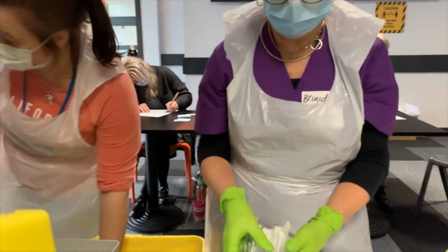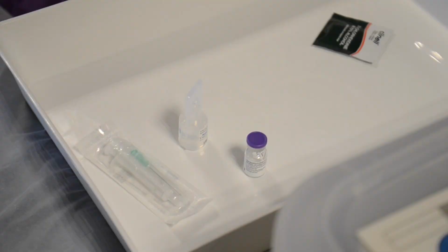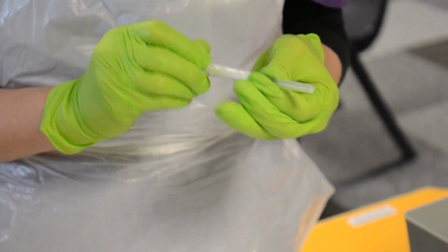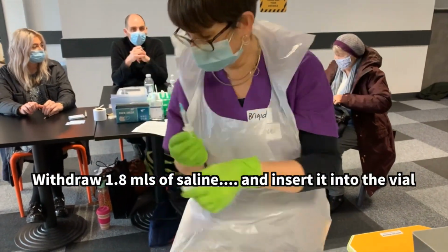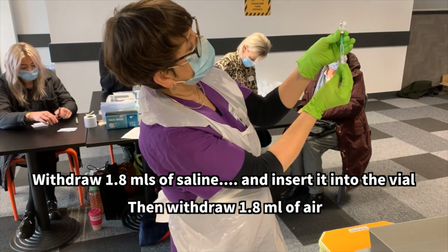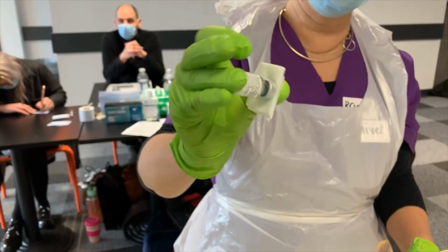Lay out 6 syringes, saline and a drawing up needle. Only 1 vial at a time should be removed from the box. Invert the vial 10 times. Take the drawing up needle and syringe and withdraw 1.8 millilitres of saline. Pick the vial back up and insert the saline into the vial and then withdraw 1.8 millilitres of air. Discard the saline needle, invert the vial 10 times again and clean the top.